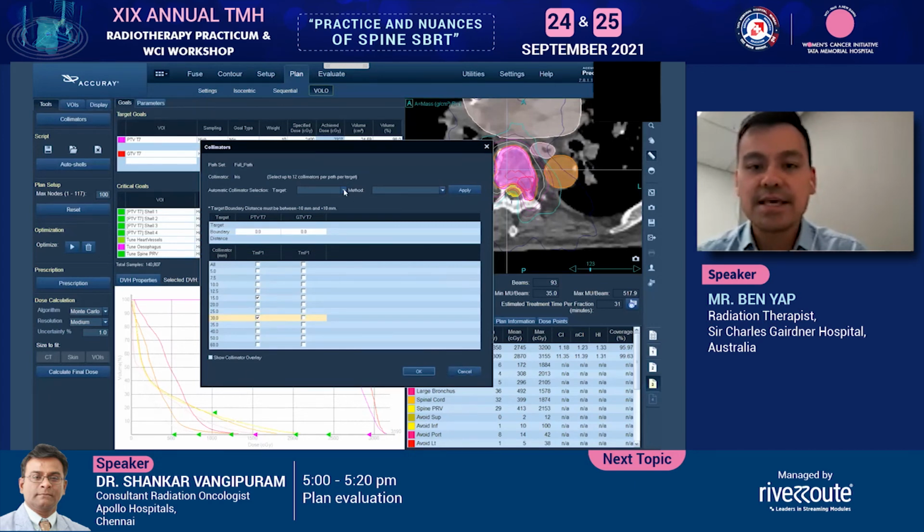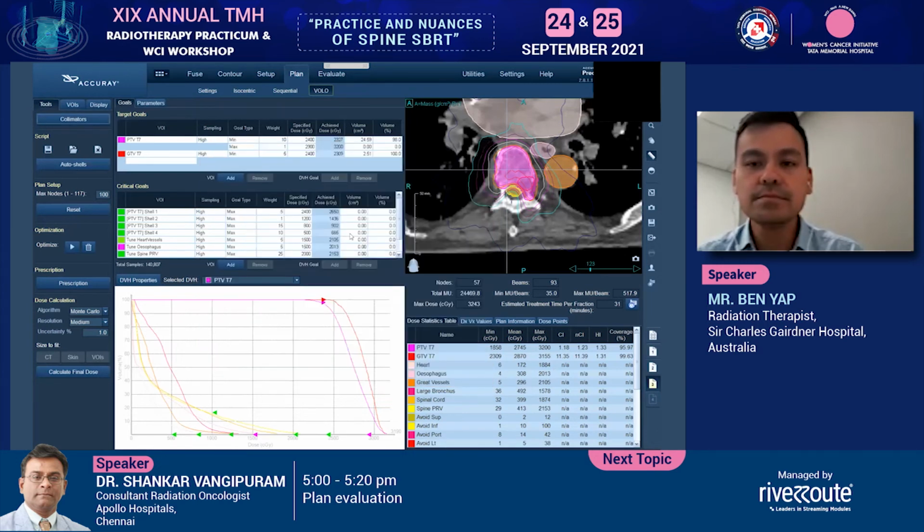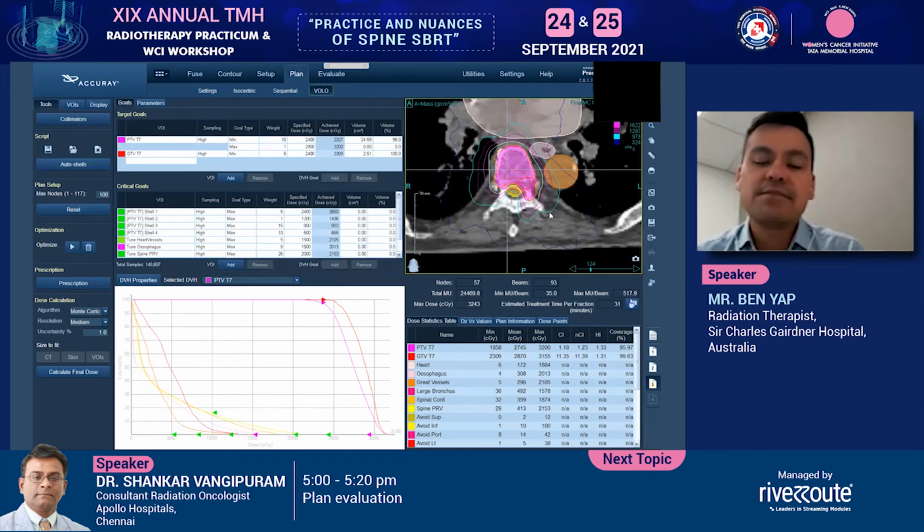This is automatic collimator selection. It's not going to give you the best or optimal collimator selection. Just keep that in mind. Now, this one's quite a simple plan in the sense that there's not too many different bits that you need to conform around, where you would normally use a mix of collimators. So in that case, I used only 2. Now, if it was quite complicated, I would recommend you use 3, upwards of 3 collimators.